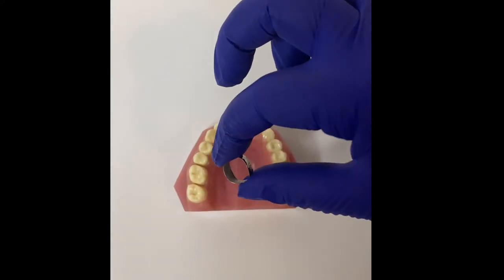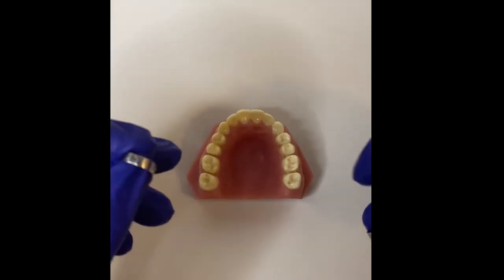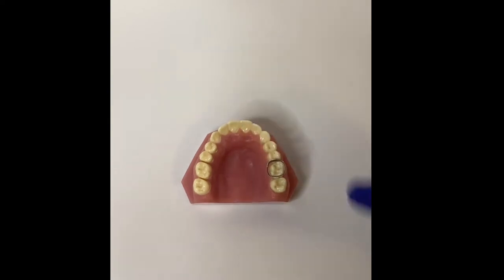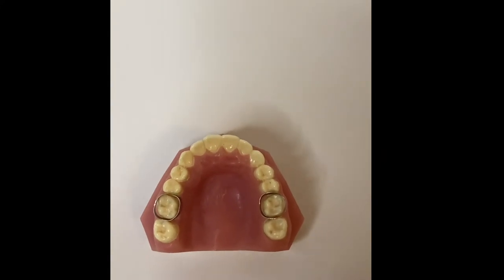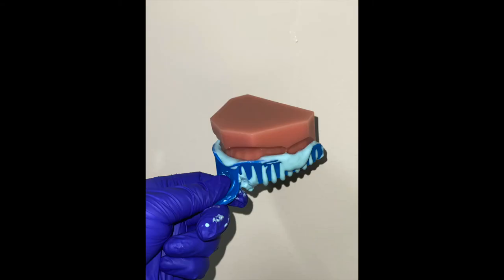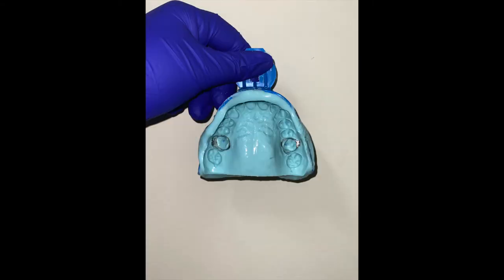After having the separators for about a week, you will come back to our office and we will do the band fittings. The bands are the little rings that go around your molar teeth. Once we find the right size, we take an alginate impression, we fabricate a model, and we send it to the lab. Typically takes anywhere from three to four weeks for your palatal expander to arrive. Once it arrives, we will schedule your next appointment.